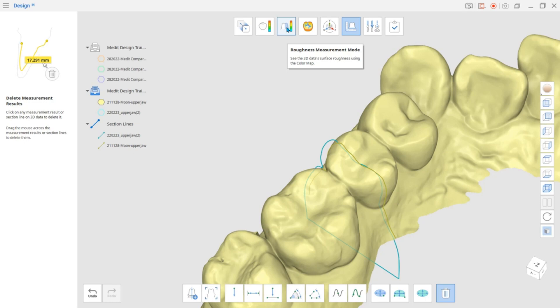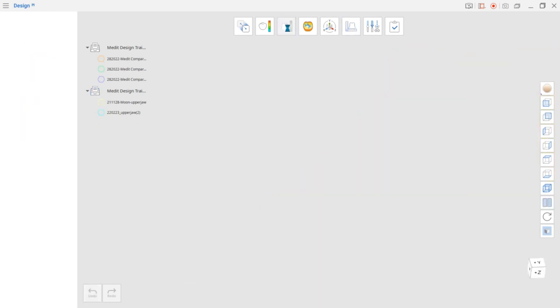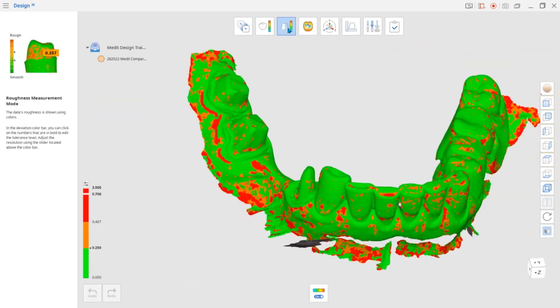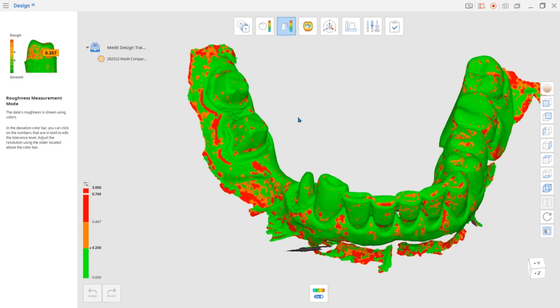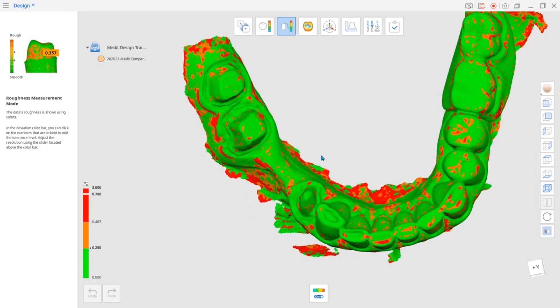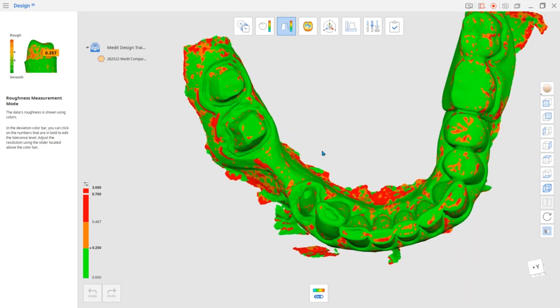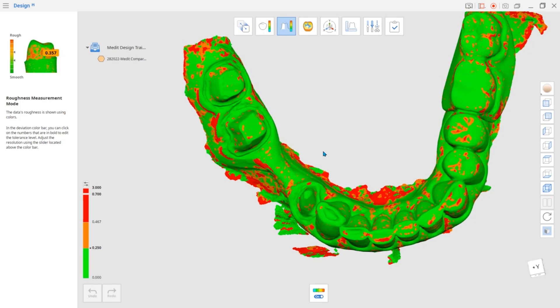Now let's look at the Roughness Measurement Mode. Refer to the color bar to analyze the roughness of the target data. The green color indicates smooth surface data. Use this mode to check the surface roughness of the prepared teeth.